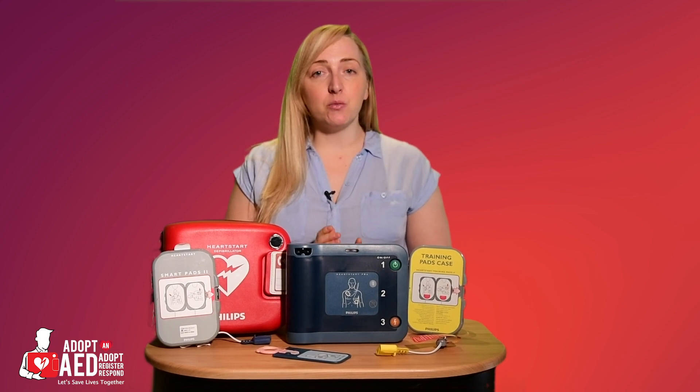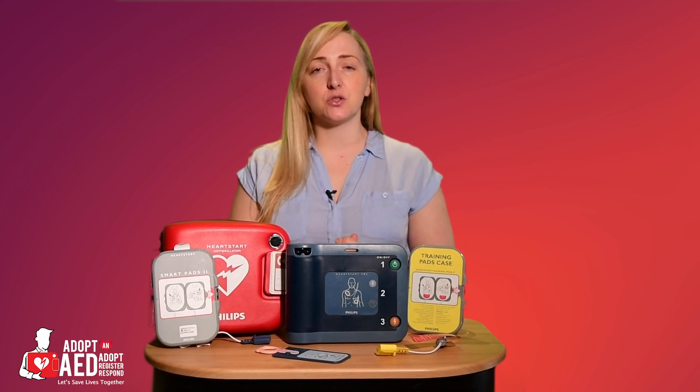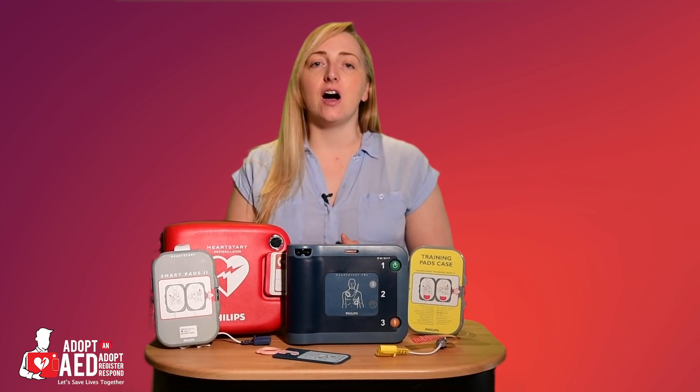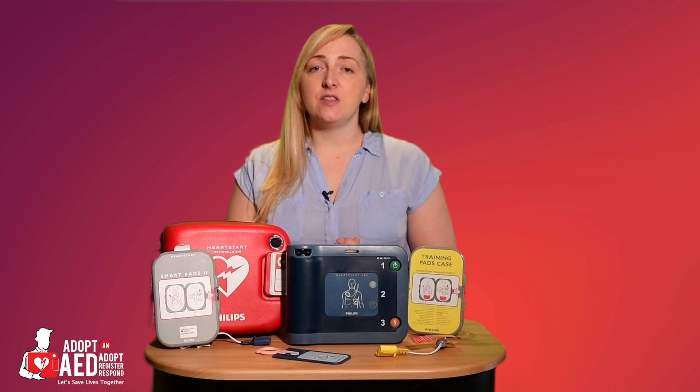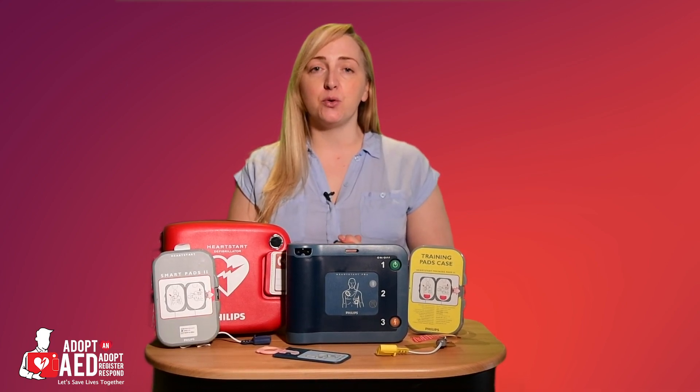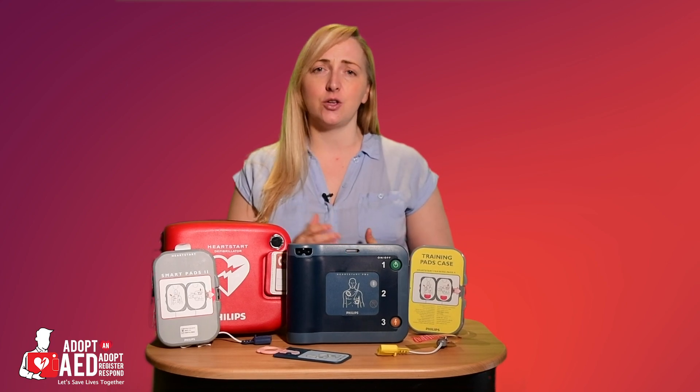When observing someone suffering a sudden cardiac arrest, you need to act quickly. CPR is paramount, but getting a shock into the heart is also important. The FRX is the ideal device for people that are trained in basic life support, for example first aiders and community responders.